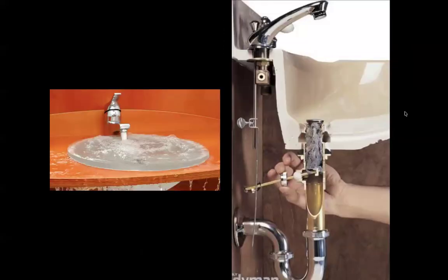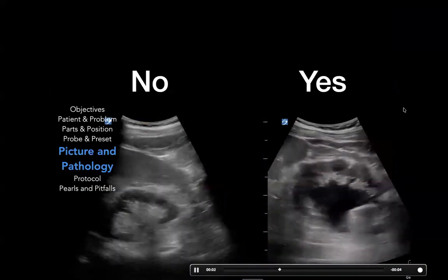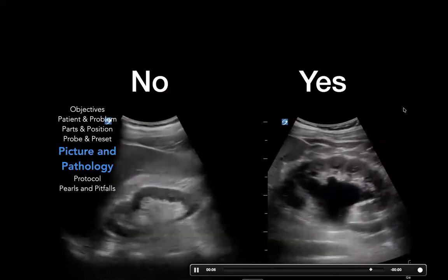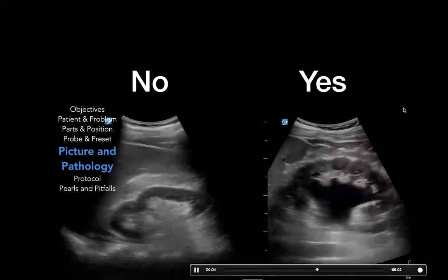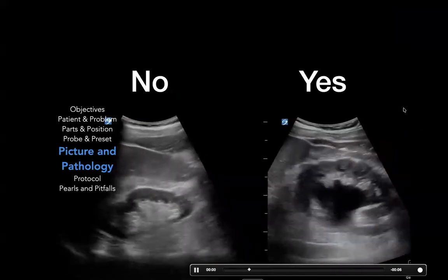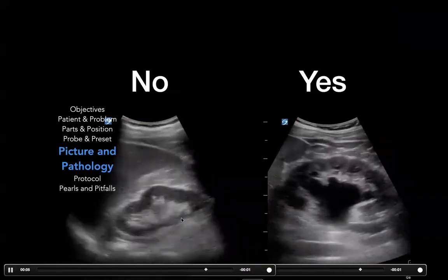Hydronephrosis is basically similar to looking at a clogged sink. You don't normally see where the clog is, but you see the backup buildup of pressure, which is the hydronephrosis. With hydronephrosis in the kidneys, it is fairly simple to see what is moderate or severe hydronephrosis versus what's not hydronephrosis and normal. As you can see, the difference between the two is very easy to tell.